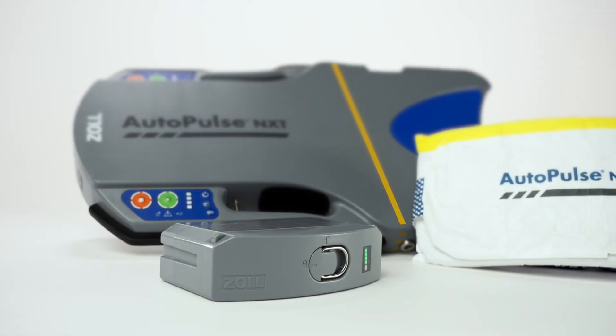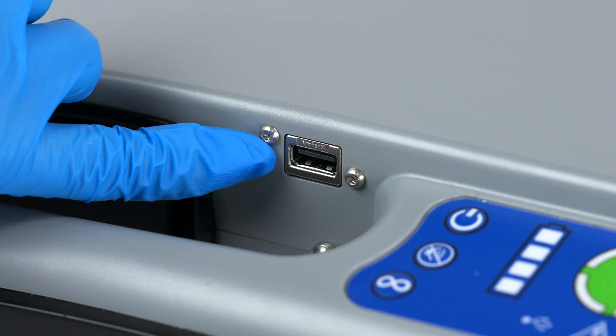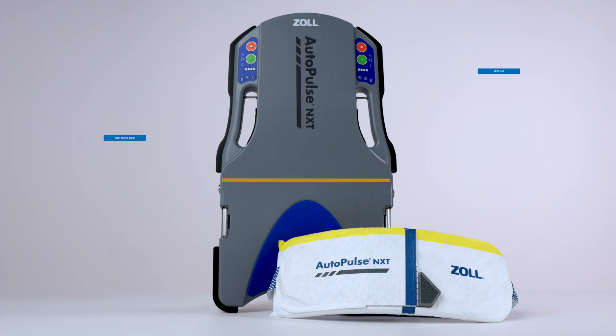The AutoPulse NXT Resuscitation System features a USB port for transferring AutoPulse NXT Performance Report data onto a USB drive. Each user control panel features a USB indicator.